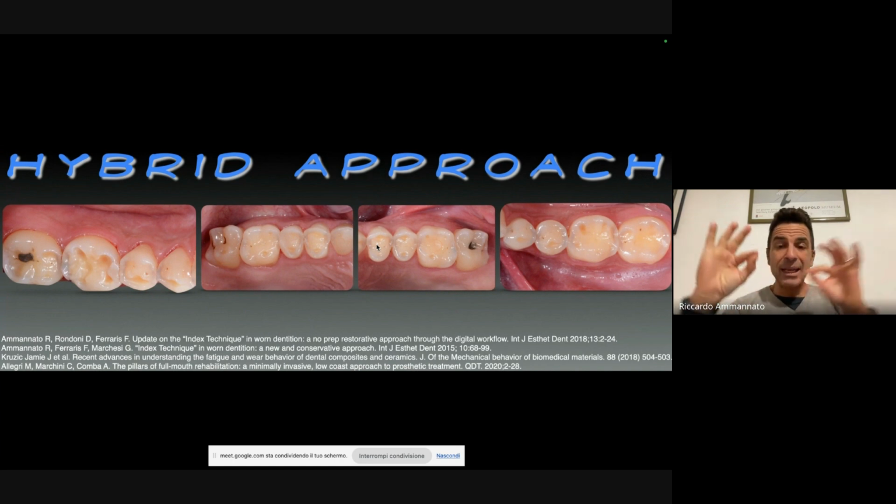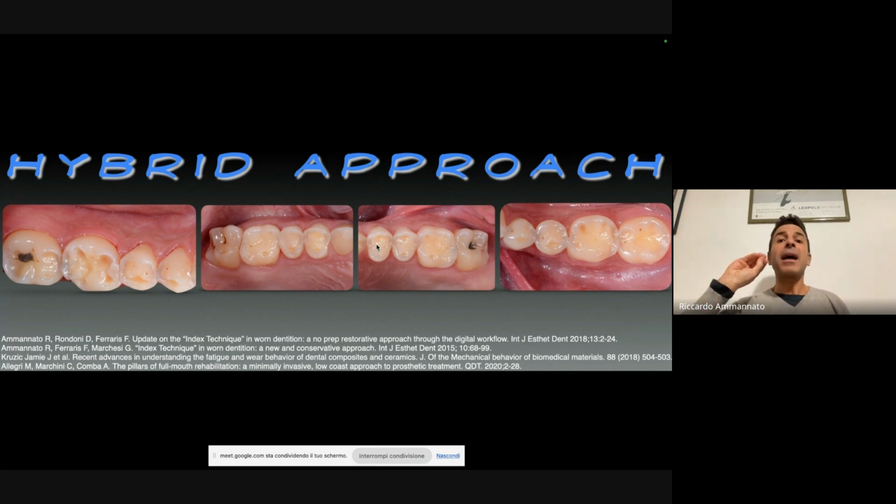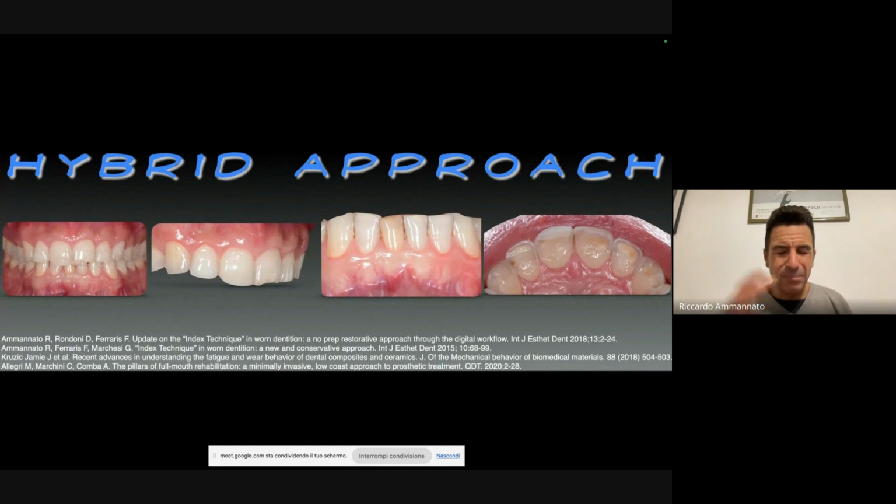That's why I usually place this kind of material on the first molars and canines, in order to have a more stable occlusion. On the other teeth, we can perform a molding approach through the index technique. So 20 teeth are going to be molded.